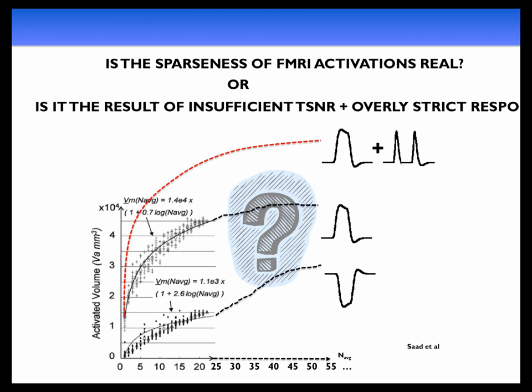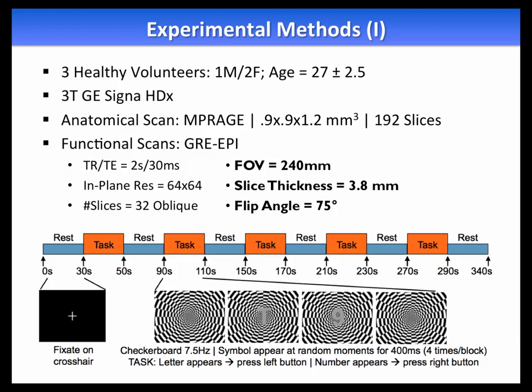I just want to end with this one point, and that is that if you do average enough, there's more signal there. This is work by a person in my group, Javier Gonzalez-Casillo. He did this study where he just averaged the heck out of the data.